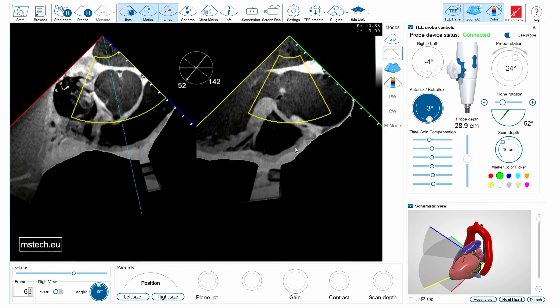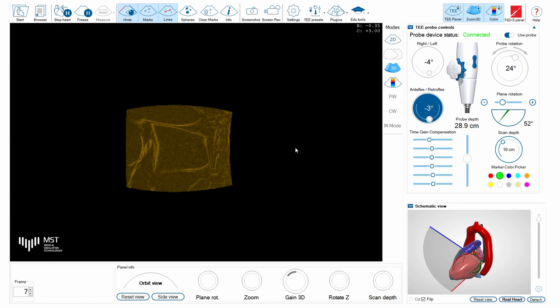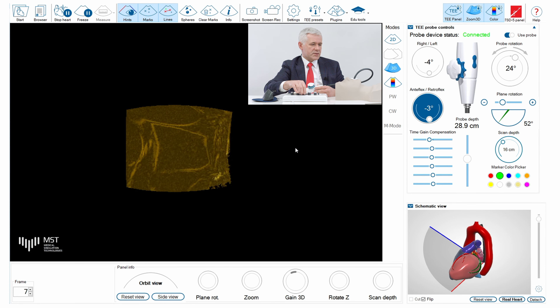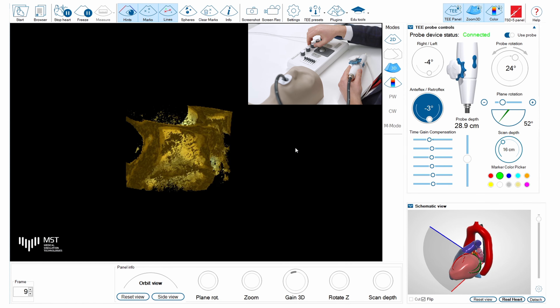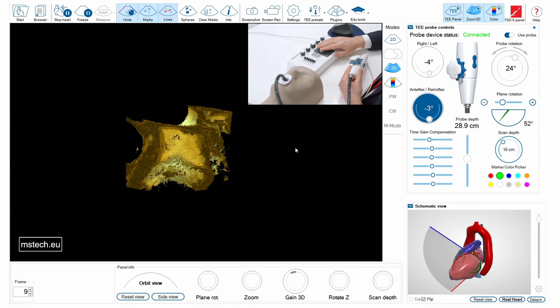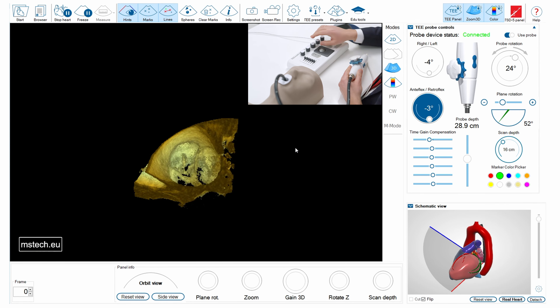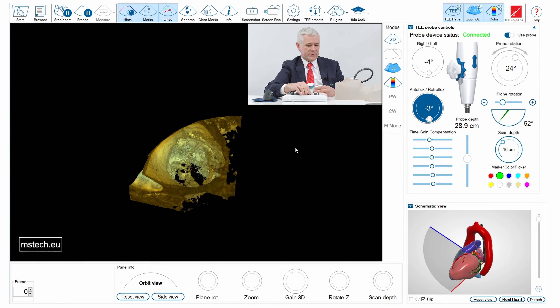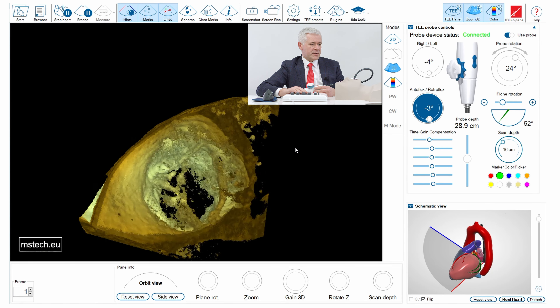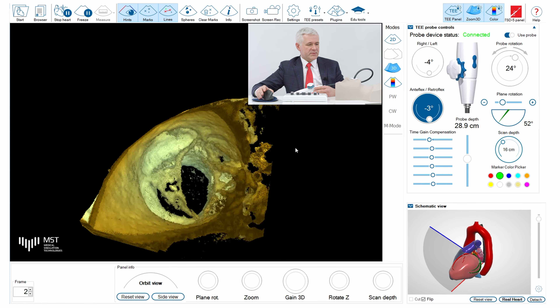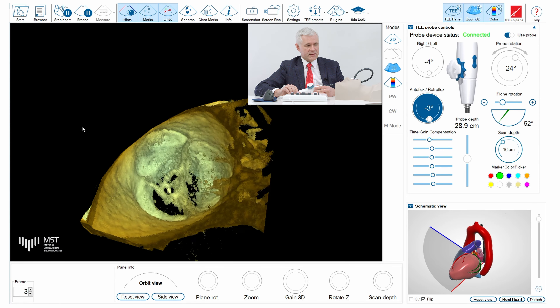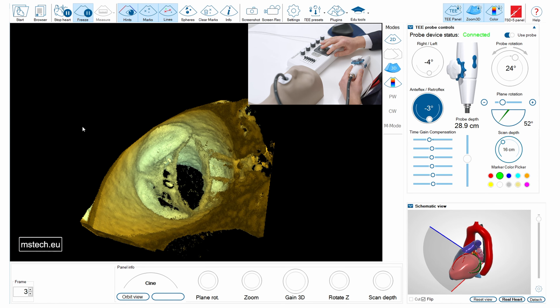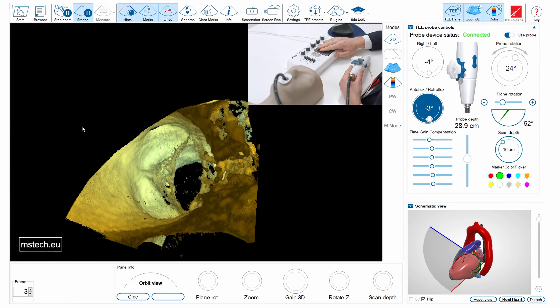I'm now decreasing the gain to obtain the best possible image. Here we have the aortic valve with the fusion of two leaflets seen on the left-hand side, with some calcium, and the orifice — the opening of the valve — is visible on the right-hand side. I can select the frame now.